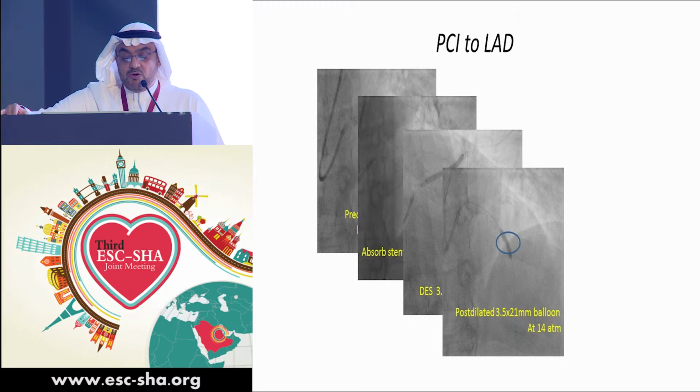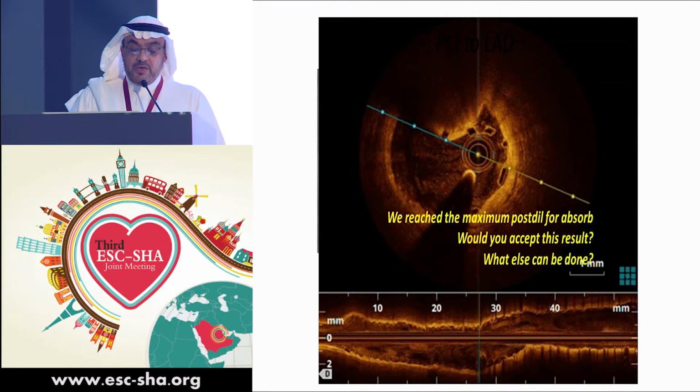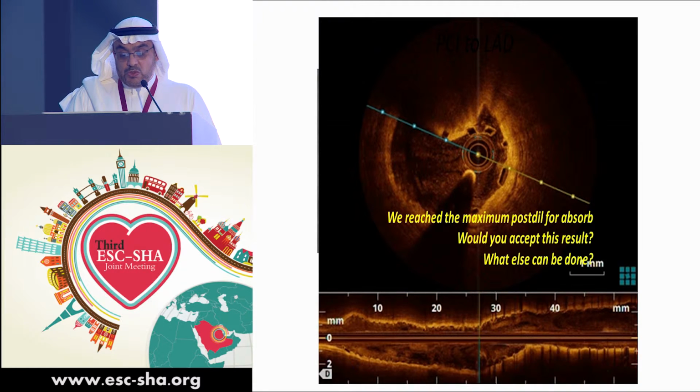We post-dilated with a 3.5 balloon, but I still ended with some waist here. So this is the final result.